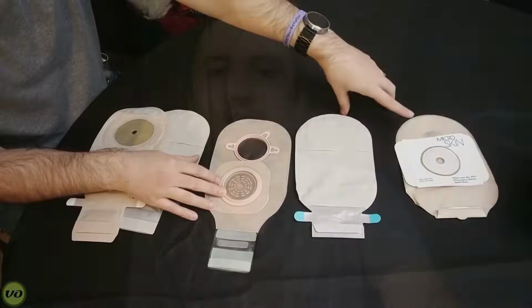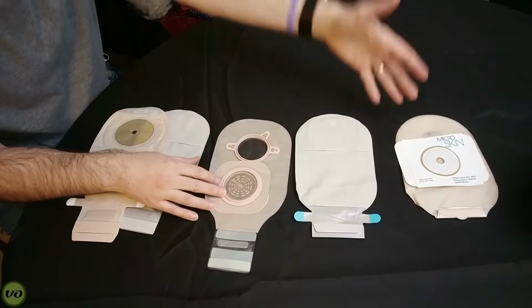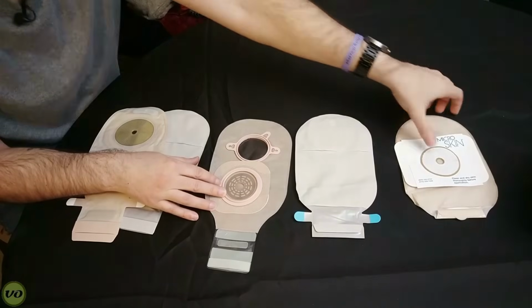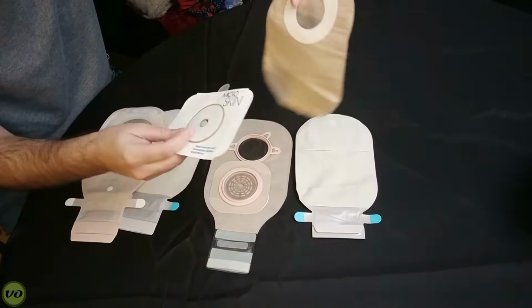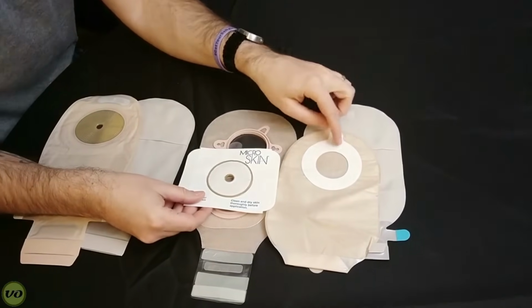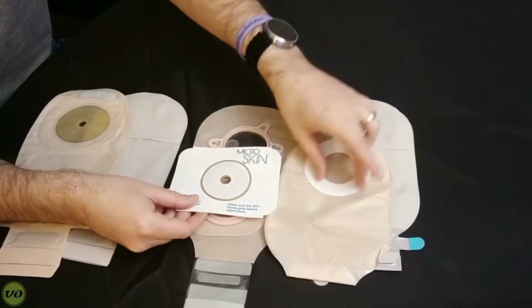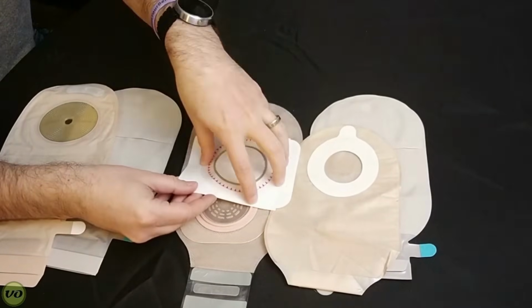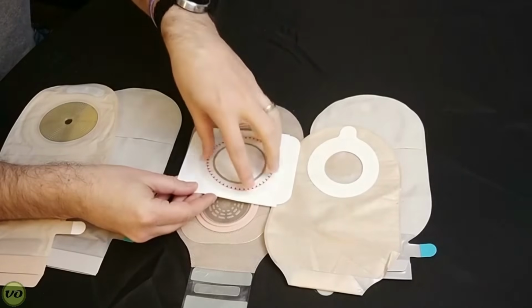I do have another example here of a two-piece system, but this does not use a mechanical coupling. It actually uses an adhesive-based system. So, for products that have adhesive couplings, what you're basically looking at is one flat section that usually has an adhesive, and then you have another section here on the wafer part that allows the adhesive to stick to it.